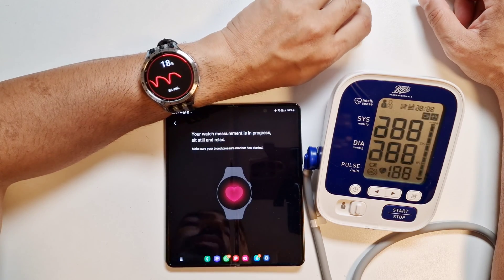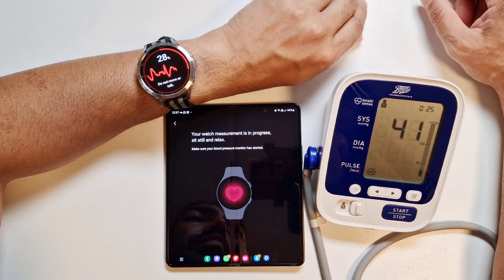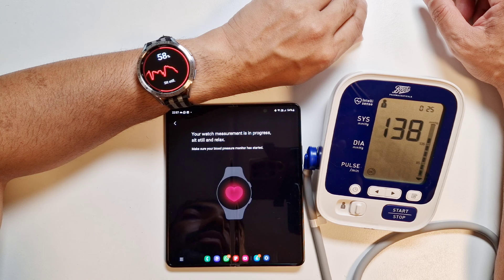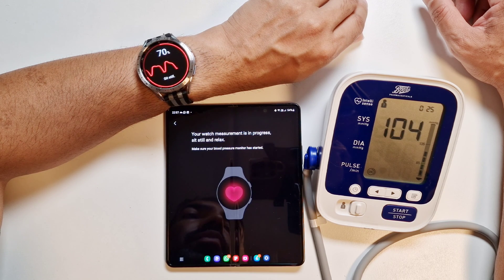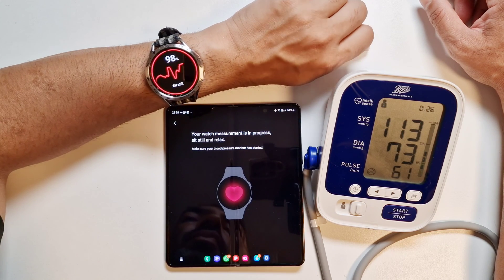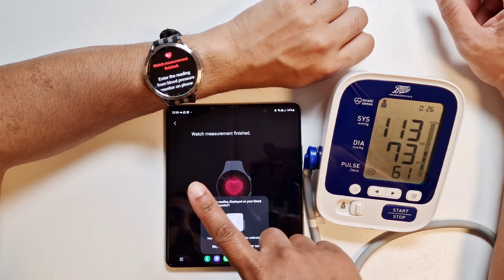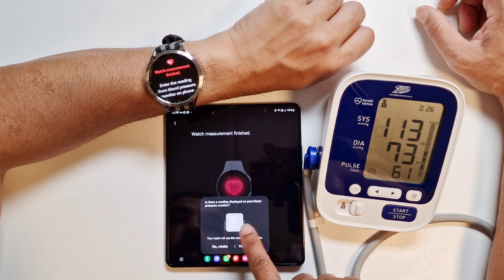We'll start and the watch has already started. The watch is measuring and the blood pressure monitor has also started — you have to make sure both do the measurement at the same time. Make sure you're sitting down and relaxing. The blood pressure monitor is done and the watch is still going. Now the watch measurement is finished — enter the reading from the blood pressure monitor onto the phone.